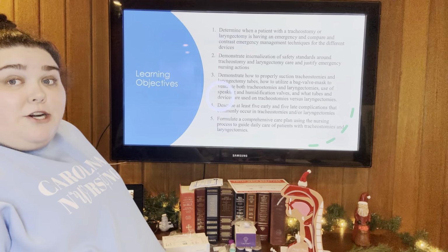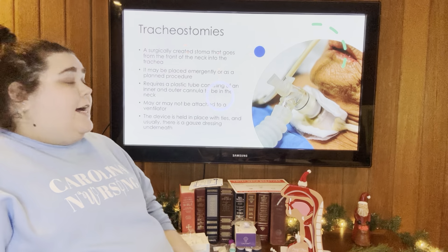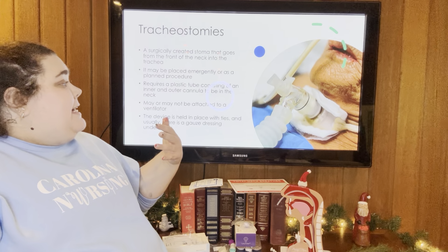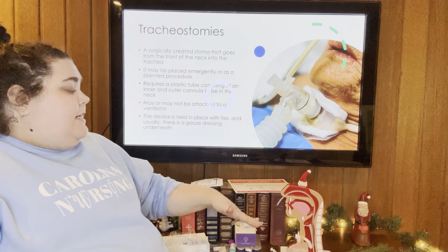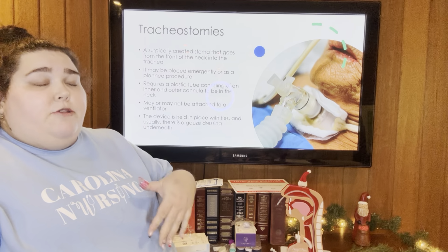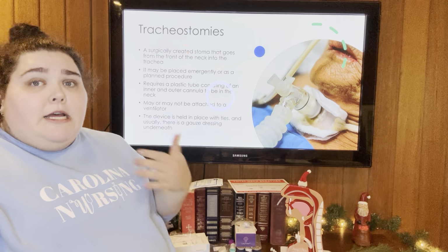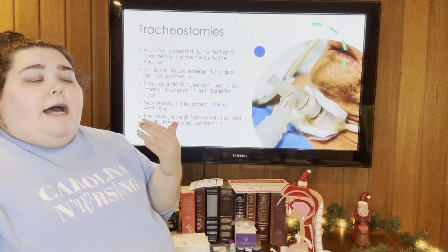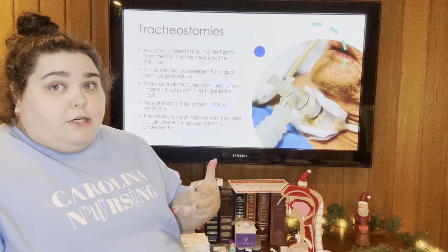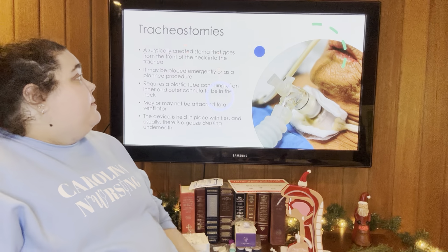So let's get started. So, tracheostomies. Tracheostomies are a surgically created stoma that goes into the airway and provides a stable way for an endotracheal tube to get into the airway. So rather than being intubated through the mouth, which we are used to seeing, intubation through the tracheostomy is going to be a little bit more stable and a little bit more of a long-term solution than oral intubation.